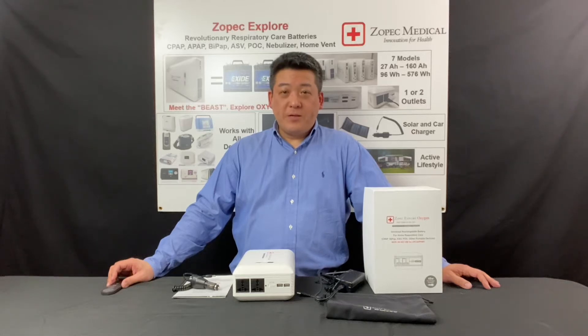Hi, welcome to Zopec Medical. This video will explain how to use the Zopec Explore Oxygen UPS battery.